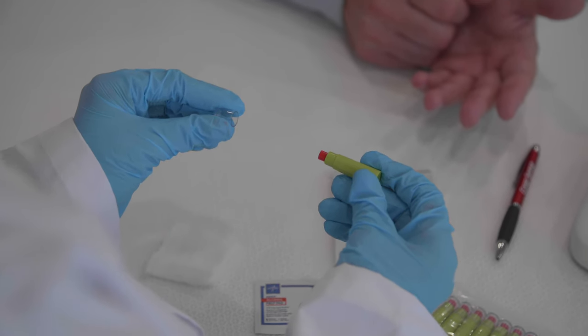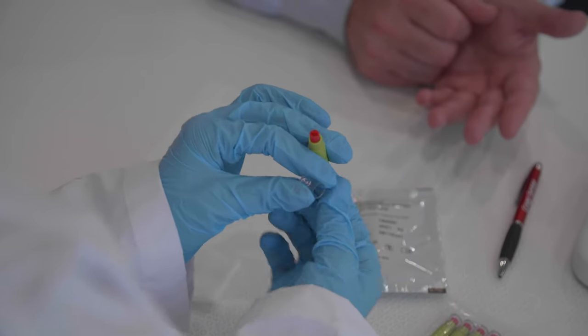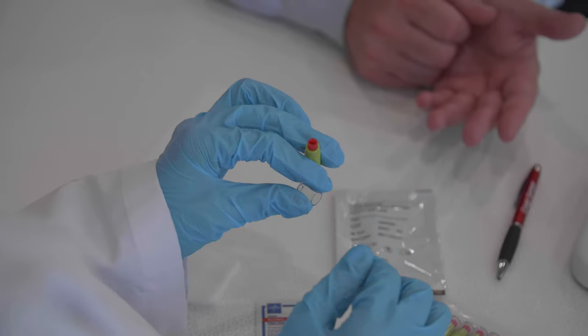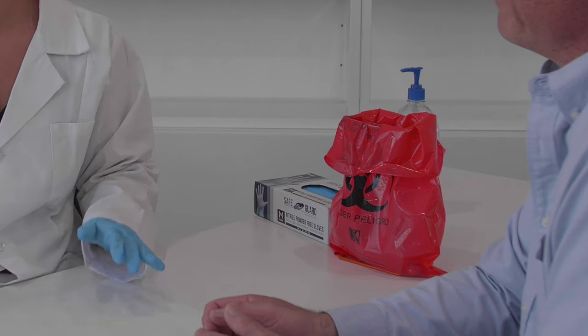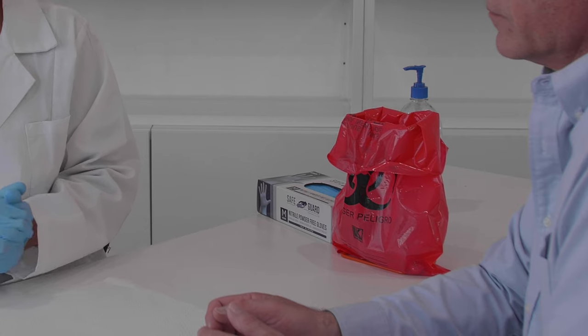Make sure that you have all the supplies needed before you start, including a 21-gauge lancet, sample transfer tubes, sterile alcohol prep pads, gauze square, and a biohazard or sharps waste container.